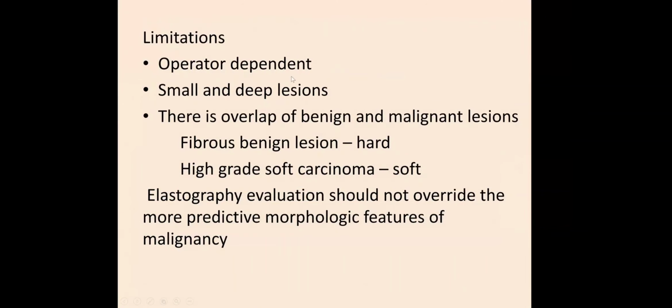But what are the limitations of elastography? It is operator dependent. When you do strain elastography, it depends on how much pressure you're putting. If you put a lot of pressure, it might increase the strain ratio. It is not good for small and deep lesions, because in deep lesions your compression might not reach them. So it's not good for small lesions either.